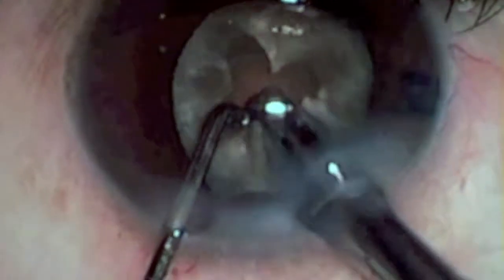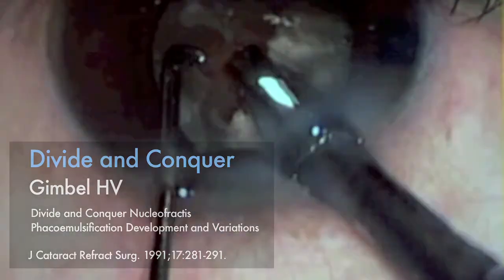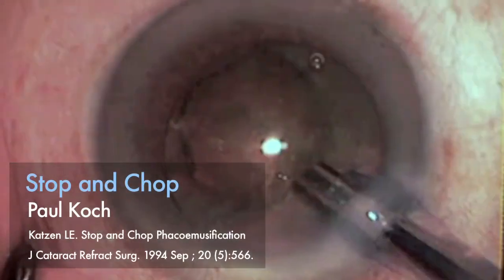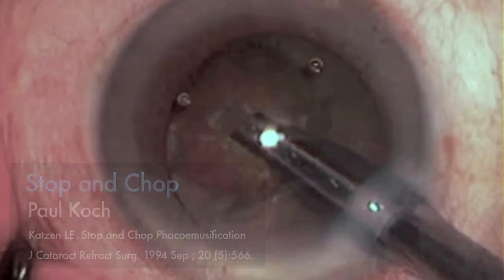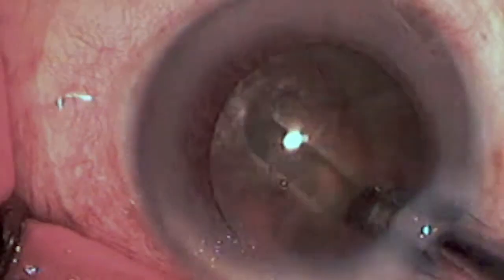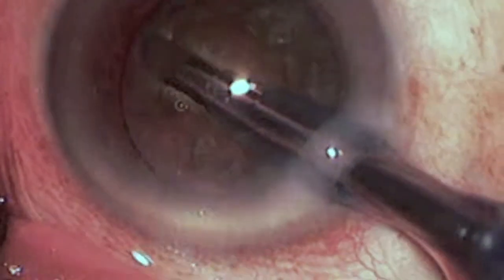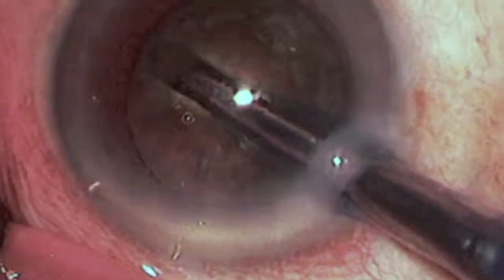Techniques which are currently used, such as divide and conquer described by Gimbel and stop and chop made popular by Koch, require wide and long sculpting deep into the center of the nucleus, utilizing compressive forces at the strongest, bulky, hard central nucleus very close to the posterior capsule to fracture the hard nucleus.